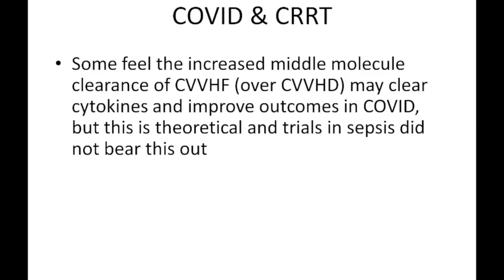A couple of practical points about COVID and CRRT. So I wanted to go back to this. An infection with COVID shares a lot of commonalities with other infections of aggressive immune responses that we might see in septic shock or ARDS. The thought is that the enhanced cytokine removal by using CVVHF, that process of ultrafiltration, might lead to superior outcomes in COVID. And so many in our field have recommended that we start with CVVHF. That same concept should hold true in sepsis as well.